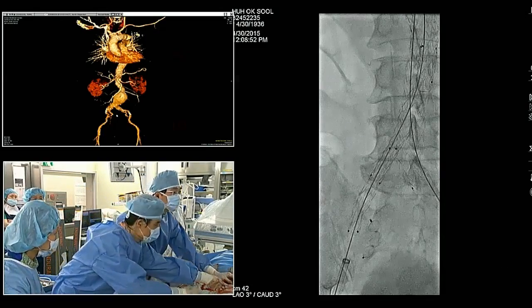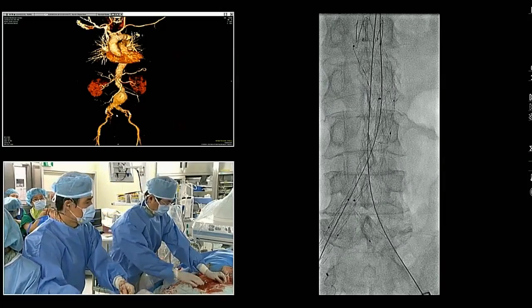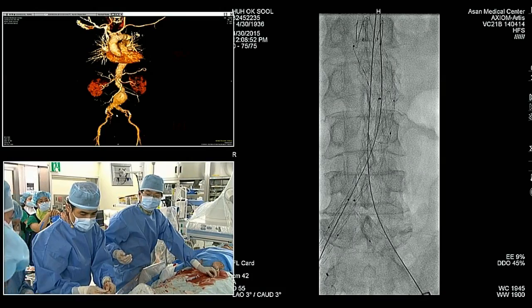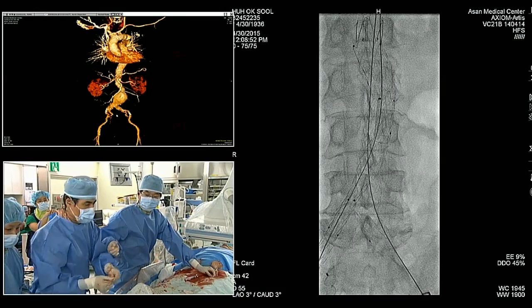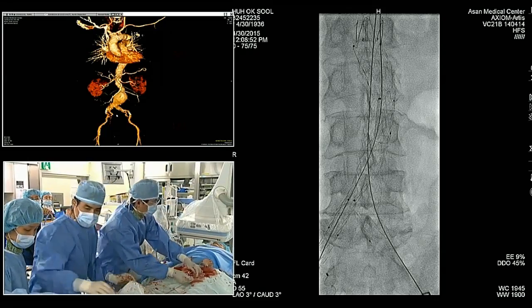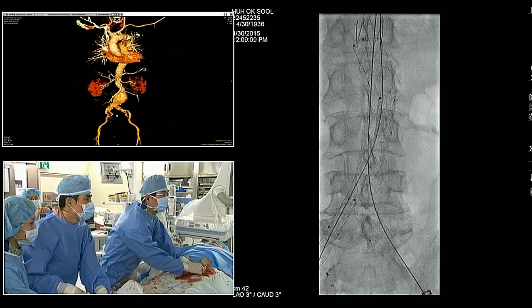And then general? Who does general for all cases? Not many. So the majority of the panel typically does their percutaneous access cases under local with conscious sedation.